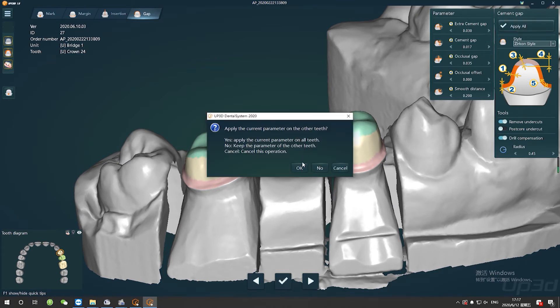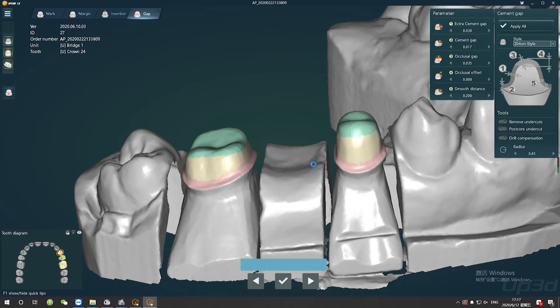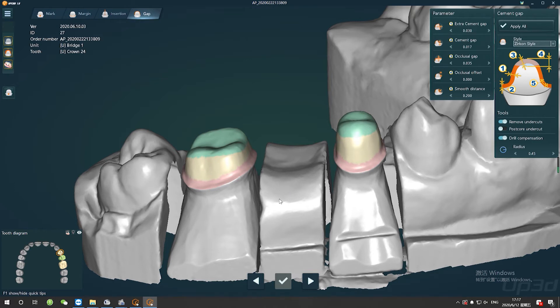And you also can adjust the parameters one by one with tooth diagram, or apply all the points, and apply the current parameters to all the same design types of abutment.